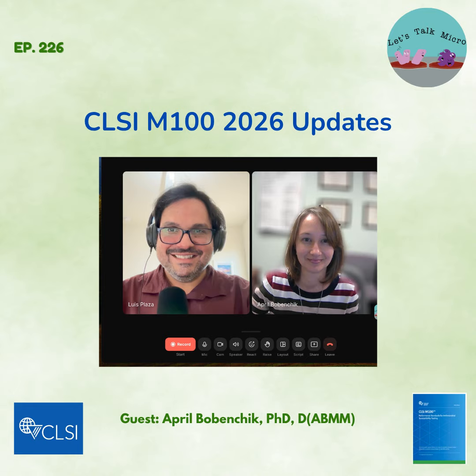And I think you've seen this also. I think we temporarily removed disk diffusion breakpoints for the Neisseria, just the disk diffusion, because we approved the MIC breakpoints first, and then we have to do the correlation studies to set the new disk diameters. That data wasn't ready in time for vote, so we review the data in the following year. When it says temporary, it just means that it's undergoing review at that moment and just didn't make it in time for that vote for that year. We're basically a year behind in terms of publishing what we're voting on.